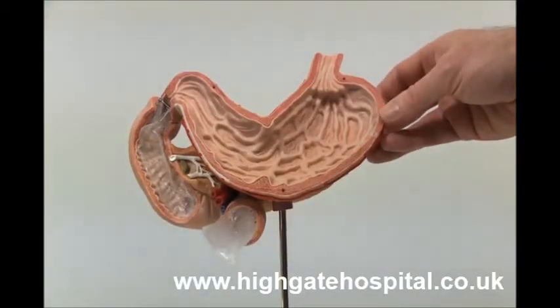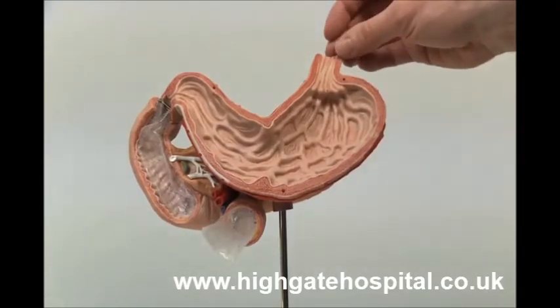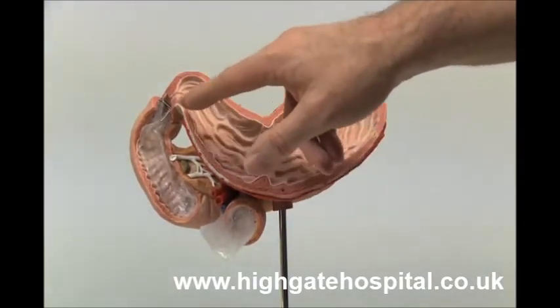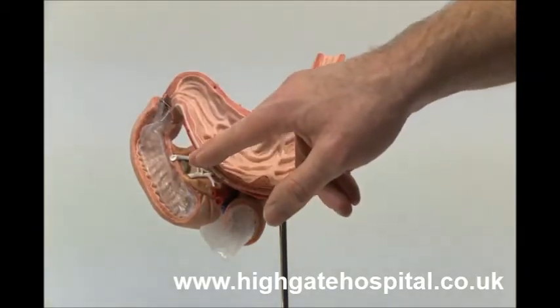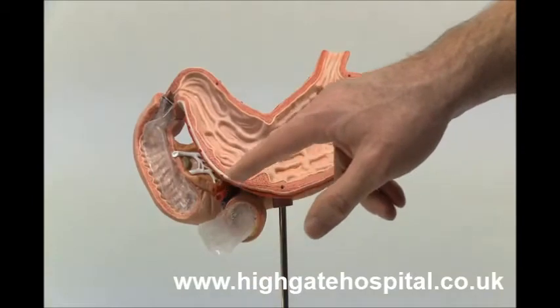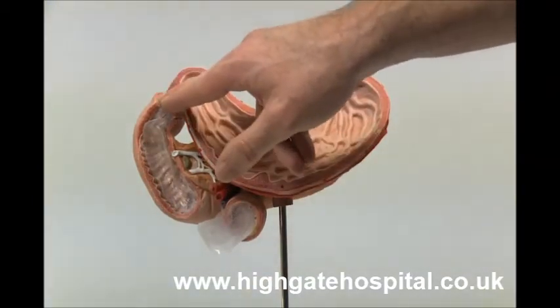This is a model of the stomach. We have the oesophagus coming down here, and then this is the stomach. Beyond the stomach we have the first part of the small bowel, which is called the duodenum, which runs around there — and this is the part where we put the EndoBarrier.